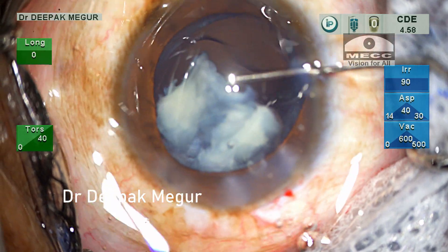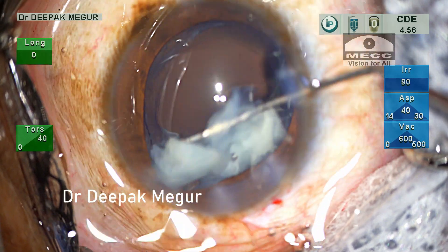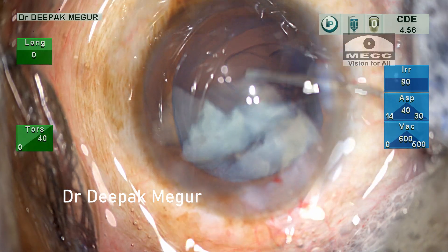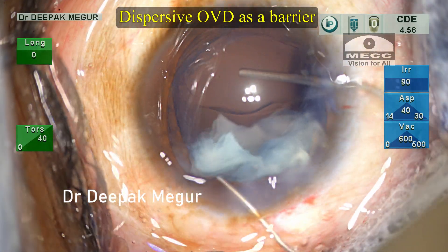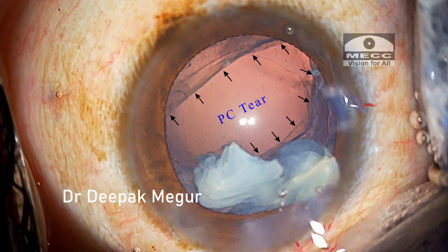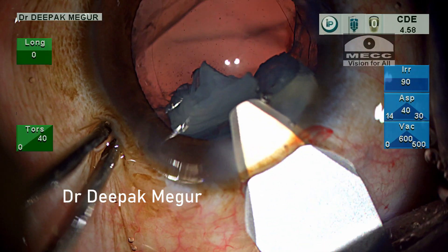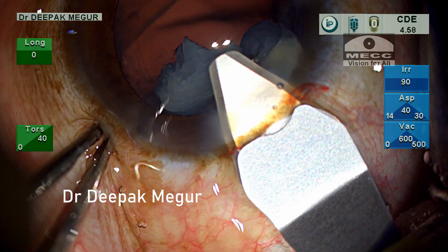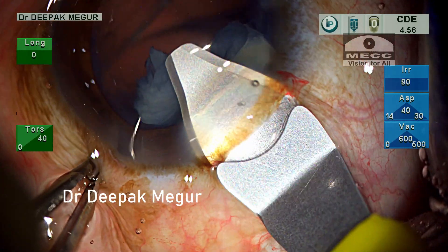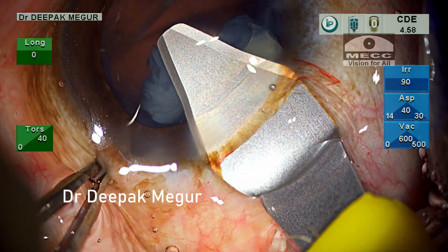On the contrary, since these are very small and soft fragments, I decided to extend the incision just a little bit and express them out manually. I just had to enlarge the incision a tiny bit — maybe around four to four and a half millimeters from the original 2.8 millimeters — to get these fragments out.